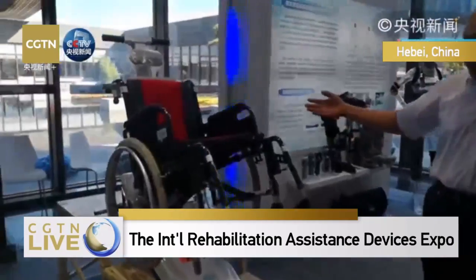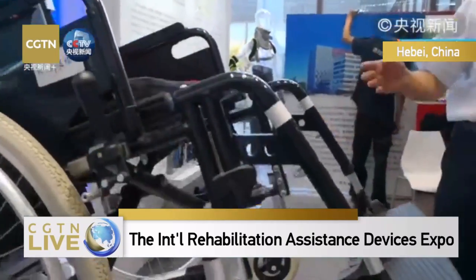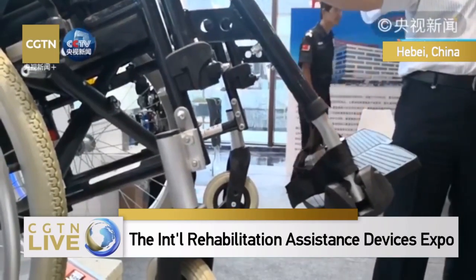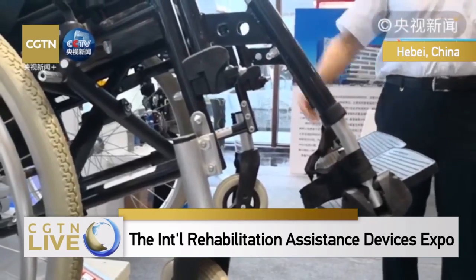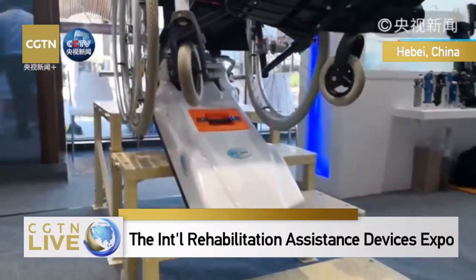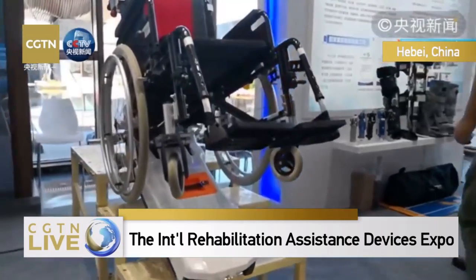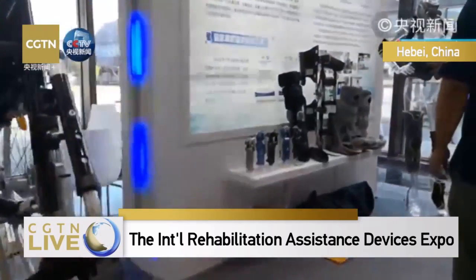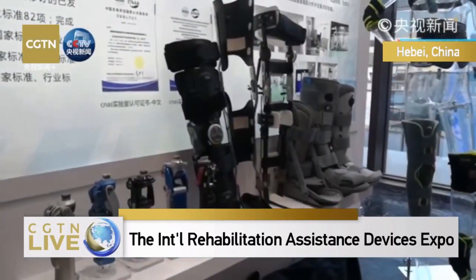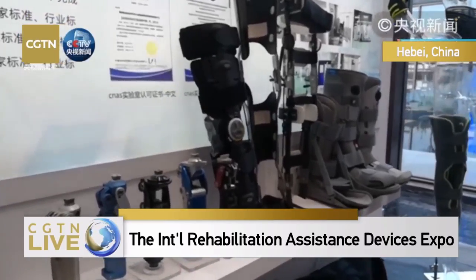This product, for example, is for those handicapped people with mobility challenges. It can help you to go up the stairs. If you're living in a building with no elevators, you can use this wheelchair to help you go upstairs. So it's like a supplement to public facilities. This is another type called the prosthetic assistant devices.